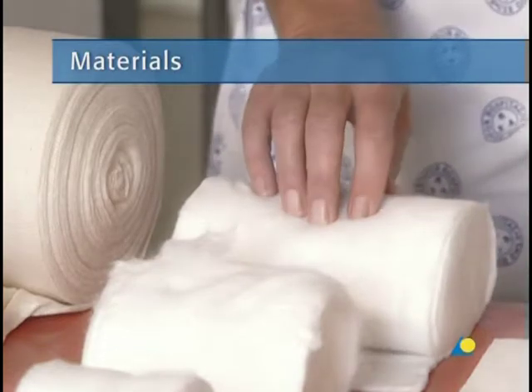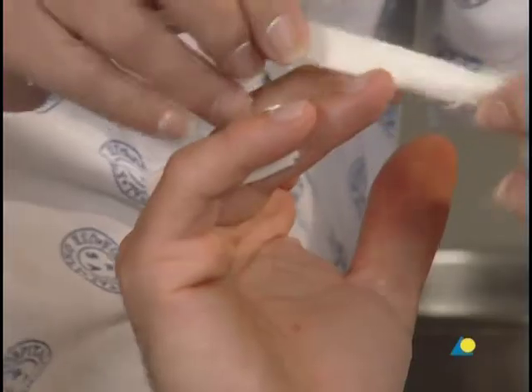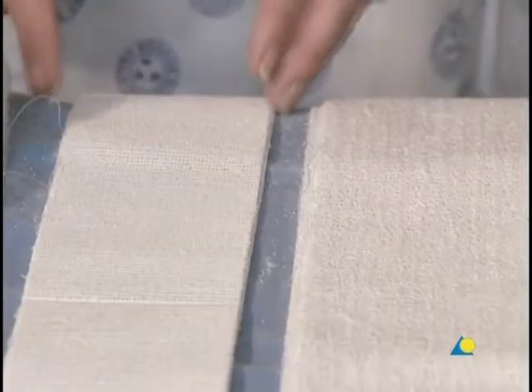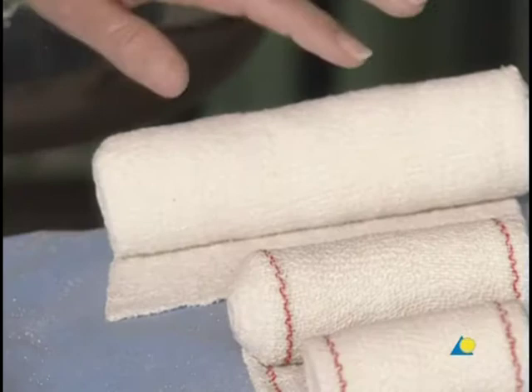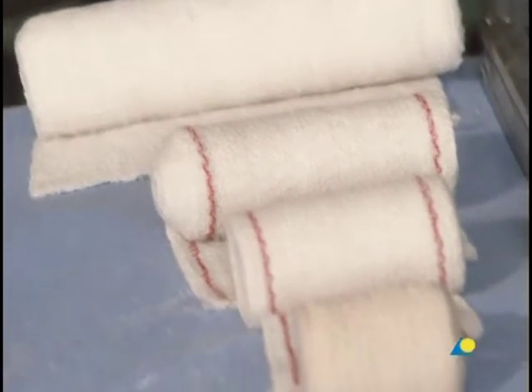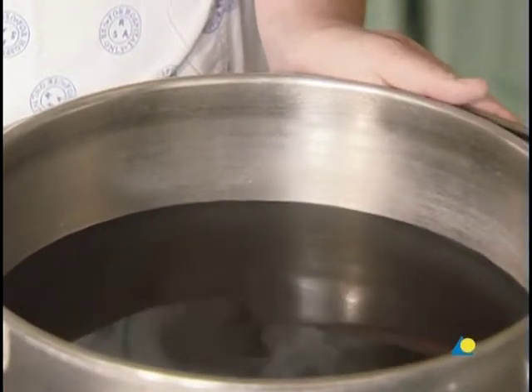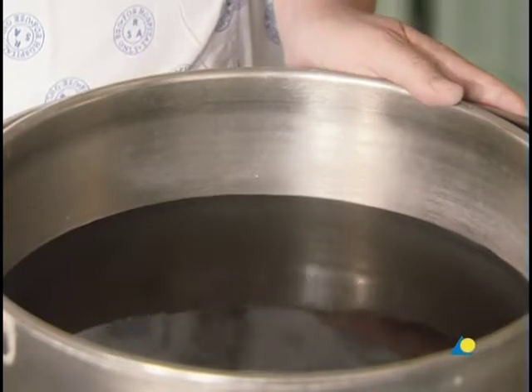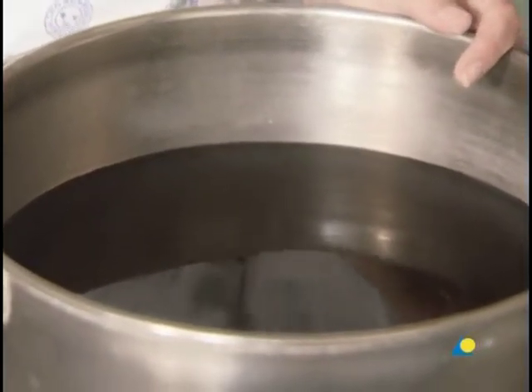To apply the ulnar gutter splint, the following materials are needed: cotton wool, used for undercast padding; surgical tape, which is used for buddy splinting; scissors; plaster slabs that are generally five layers thick and available in differing widths; a crepe bandage to secure the plaster slabs; and water, or another wetting agent. The water should be tepid or lukewarm with an ideal temperature of between 22 and 25 degrees Celsius. Colder water or a bandage that is wetter will allow for an increased working time, while warmer water or a bandage that is drier reduces the working time.